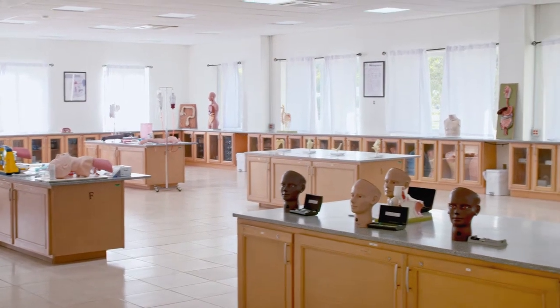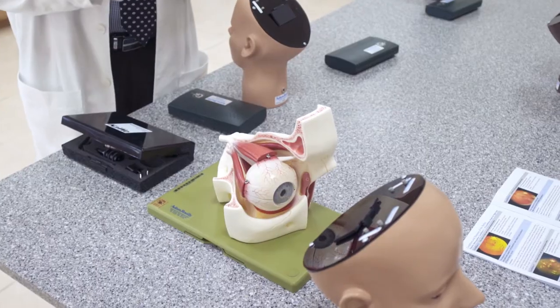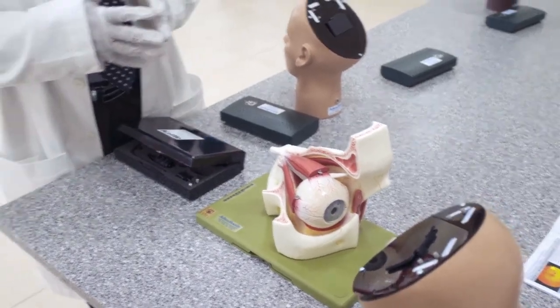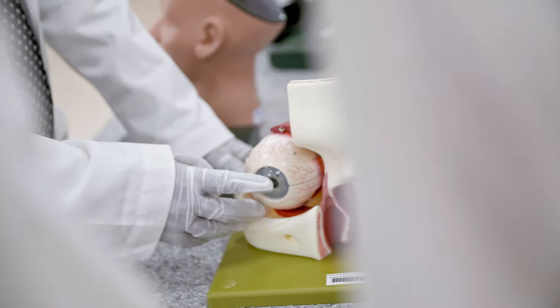Here in the skills lab we have all the skills to which you are required to be proficient with. This is your ophthalmology station, and today you are going to be looking into the eyes. You'll have to concentrate on the pupils because the light passes through the pupils, then enters the posterior chamber, passes through the lens, and then the posterior segment where you have the vitreous, and then behind it is the retina. The light basically passes through all these layers, which must be clear enough so that the light can go through.